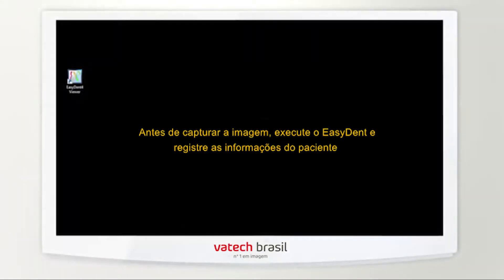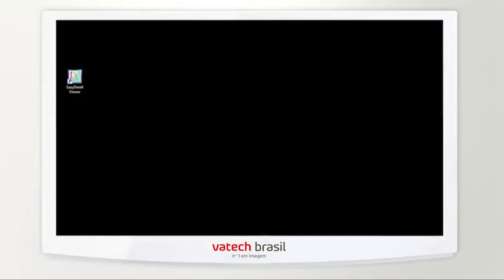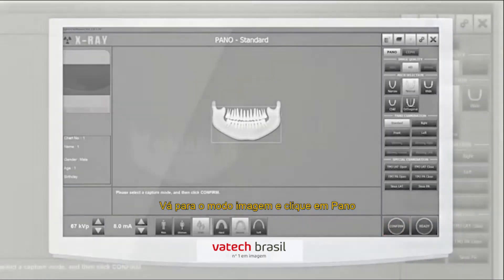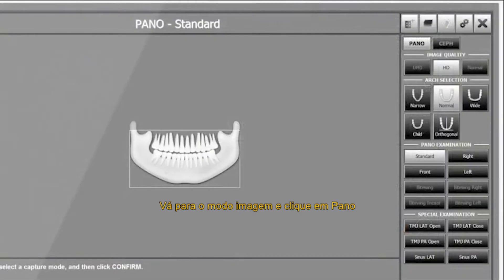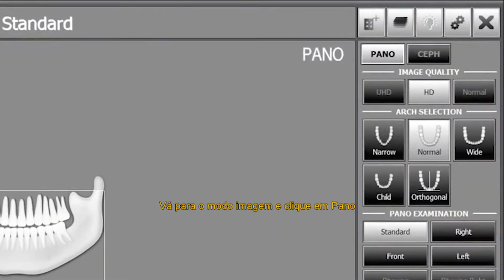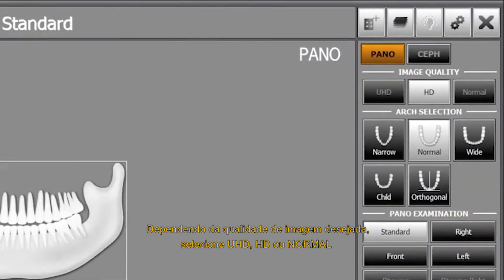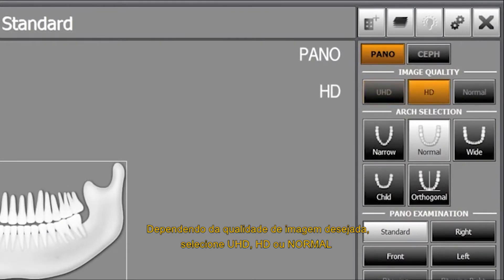Before image capturing, execute EZDENT and register the patient information. Go to imaging mode and click the pano. Depending on the image quality which operator wants, select UHD, HD or normal.